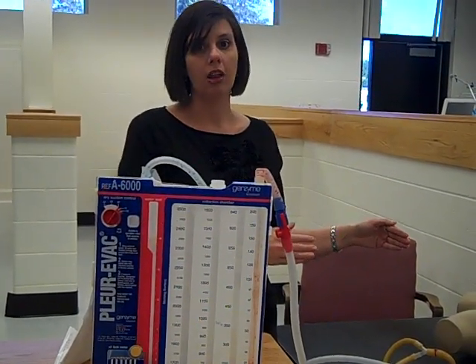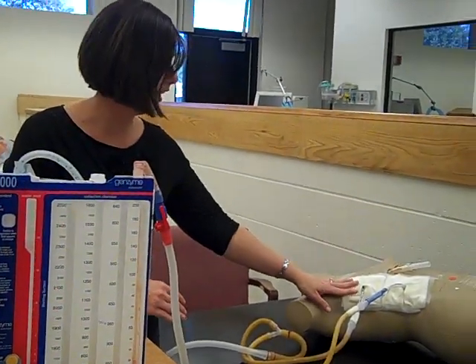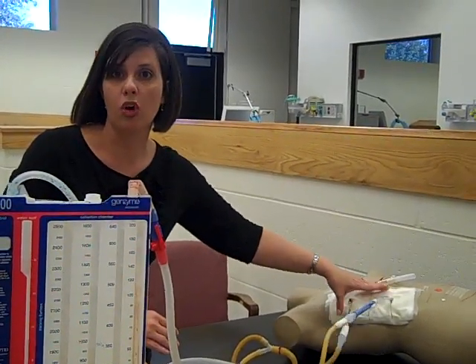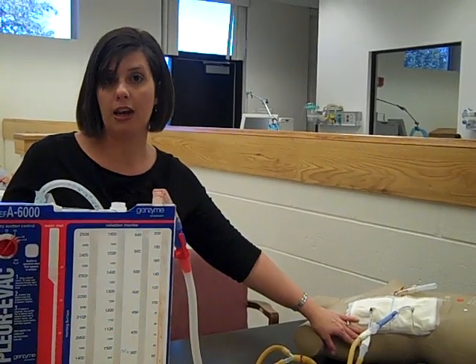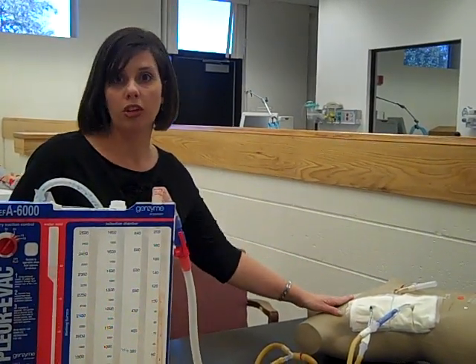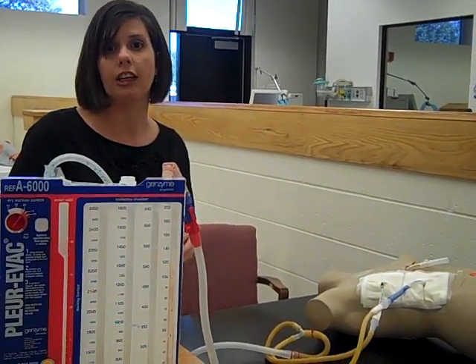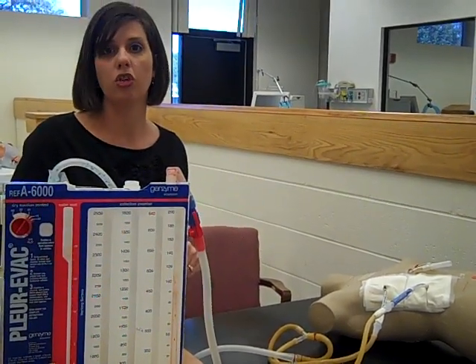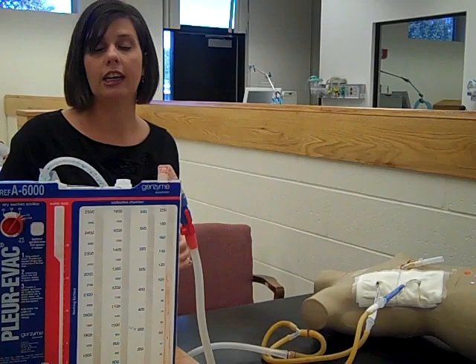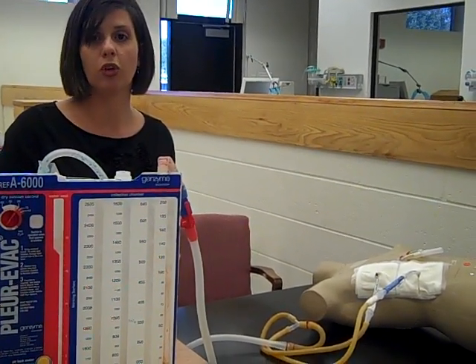Then you need to verbalize that you would also complete an assessment looking at the dressing, palpating lightly for crepitus around the tubes. If you notice crepitus, you need to mark it. It should not be expanding. It should be getting better each day. You're going to do pulse oximetry. You're going to look at color, listen to lung sounds bilaterally, assess the trachea for a midline position, and make sure that you note your ECG tracing for any differences or possible arrhythmias. This concludes the chest tube for CPEs.